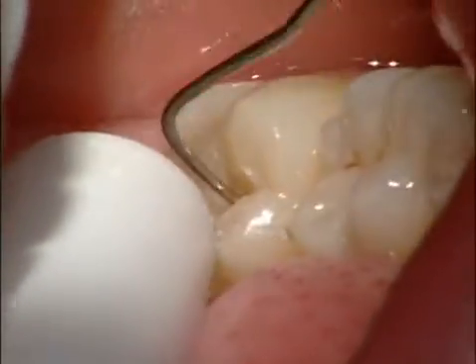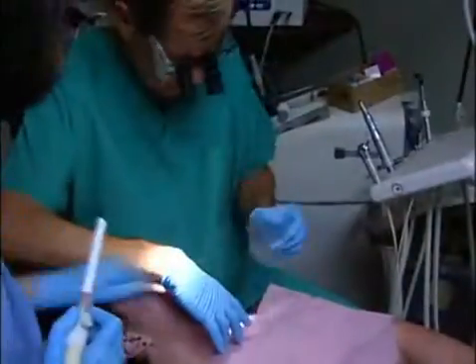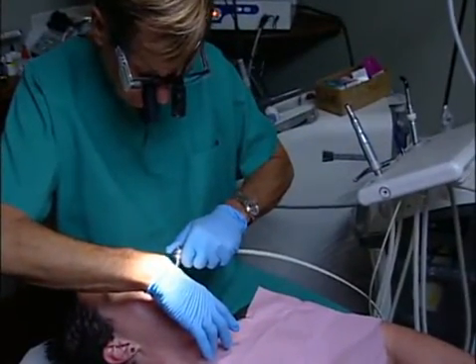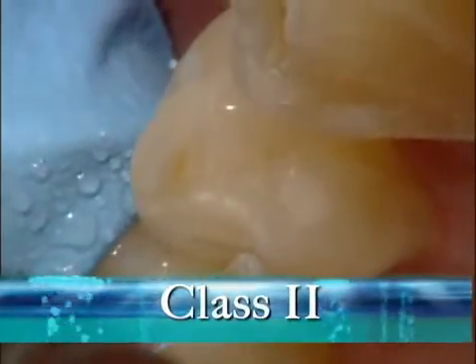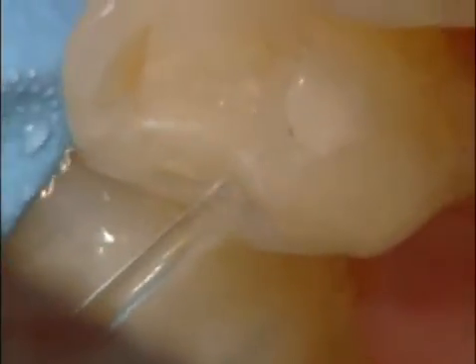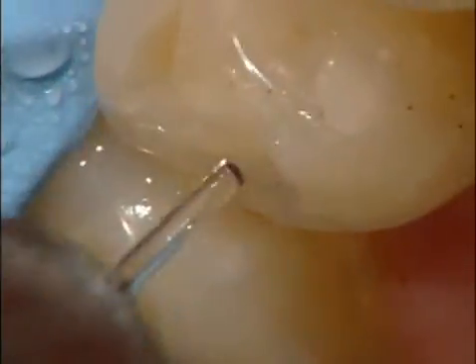Now, there'll be times in the occlusal surface where you're cleaning out the pits and fissures prior to placing a sealant. This can easily be accomplished at 2.5 to 4 watts, at 30 hertz, 20% to 50% water, and 70% air. You can expect these procedures in the occlusal surface to take you anywhere from 30 seconds to 2 minutes to perform. Once you've obviously done a few procedures, you become more efficient and your frustration level is greatly reduced. What I found certainly is practicing on a few extracted teeth made my efficiency rating dramatically increase when I first got the laser.